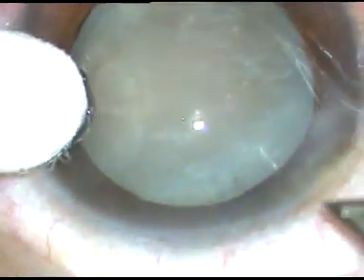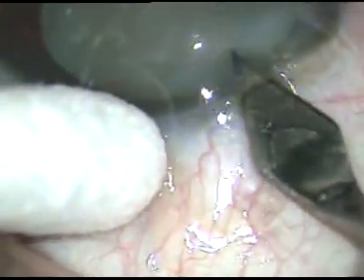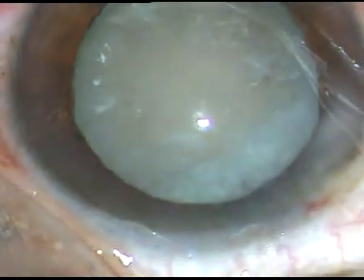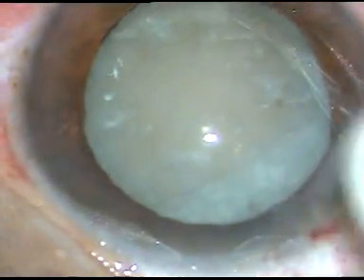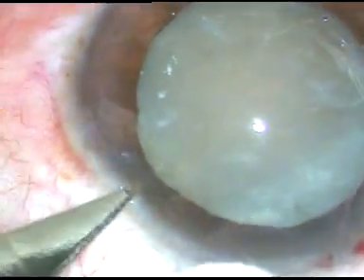This is the main incision — a 2.8 mm incision. See that I am supporting the eyeball with a cotton-tipped Johnson bud and I am not using any fixation forceps, thus avoiding subconjunctival hemorrhage.